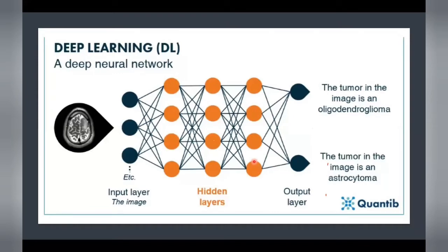And the first set of pixel data is being analyzed by an algorithm. Suppose you have a pixel of a nucleolus, which is hyperchromatic. That one dot is picked up and analyzed and it says this is a hyperchromatic dot, and it passes on to the next hidden layer where still more complex calculation takes place, looking into the regularity of that hyperchromatic dot, all those things.